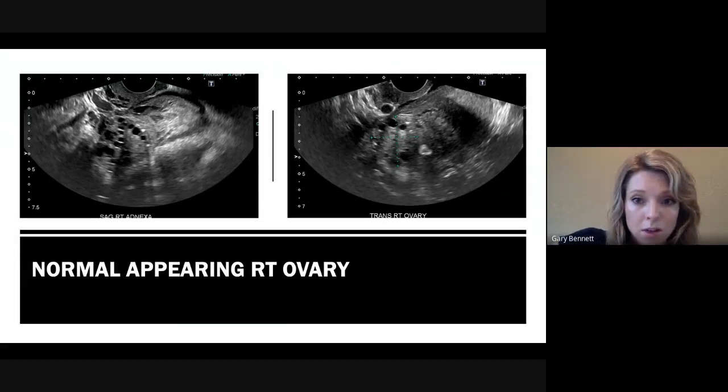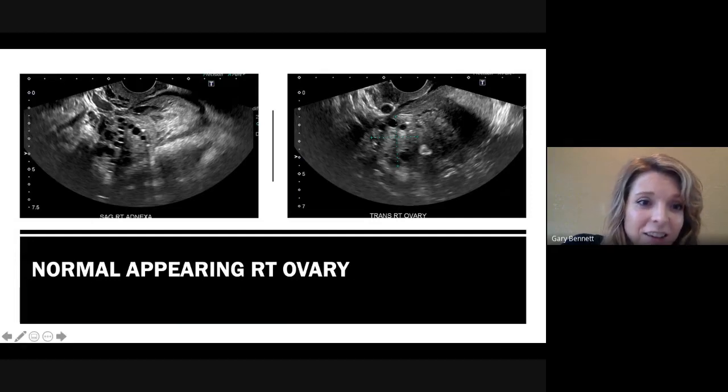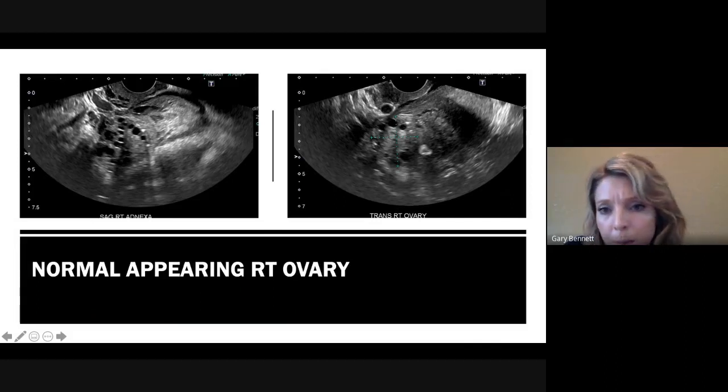So let's go out to the adnexa. Here we have a very normal, luscious right ovary, nice and big, all these beautiful follicles, very fertile patient. Not always quite that easy to find an ovary, but this one's nice and big. We have some nice, good measurements on it there. We're out in the adnexa. You can see some bowel out here.